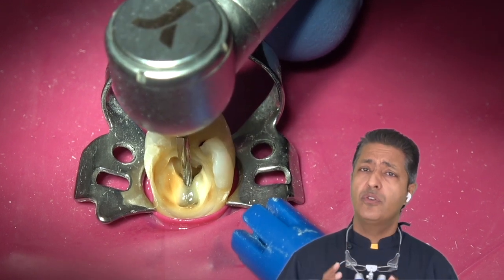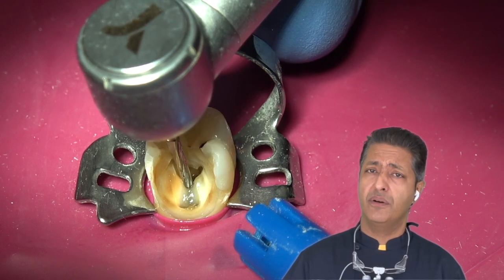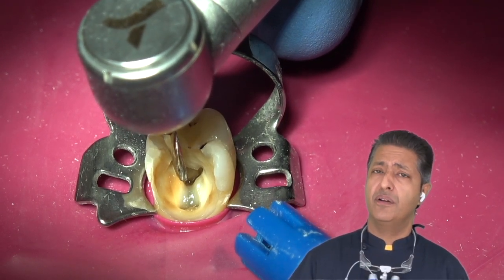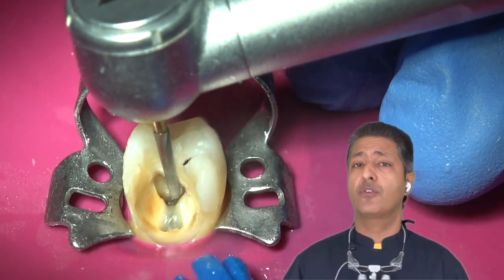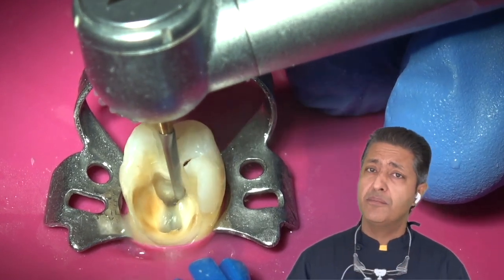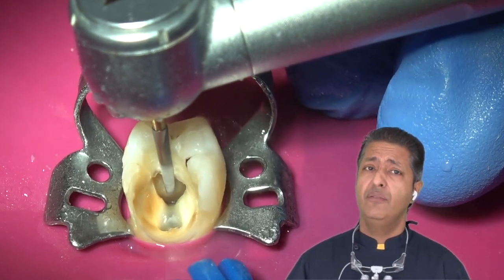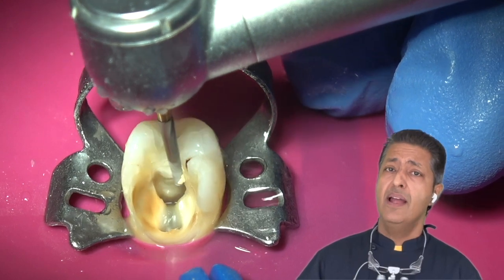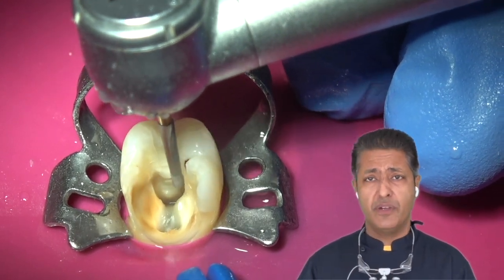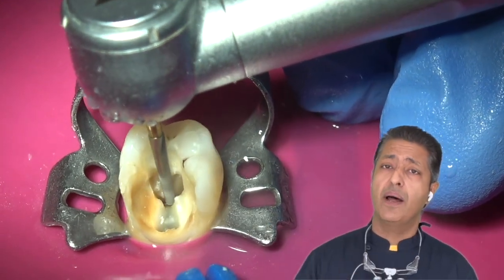do is use the same endo-Z burr, but take care that before using the endo-Z burr, touch the tip of the endo-Z burr on the pulpal floor as you can see here, and then lift it 0.5 millimeters and then start rotating it. Because if we touch the pulpal floor, then we are damaging the tooth structure here, which is not our intention. We just have to perform lateral cutting on the wall which is having overhang and bring it to a position where the junction of the pulpal floor and the axial wall are in one line.